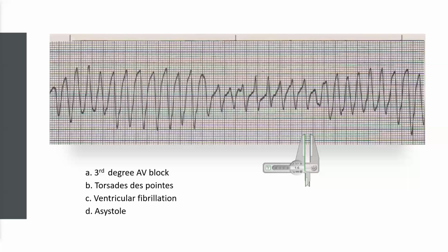Could you please indicate in the chat what your answer is? Okay, most of you were able to get torsades de pointes. What is torsades de pointes?